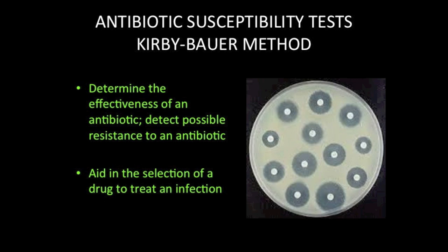In this lab session, we will examine the results of an antimicrobial susceptibility test. Antimicrobial susceptibility tests are performed to determine the effectiveness of an antibiotic.